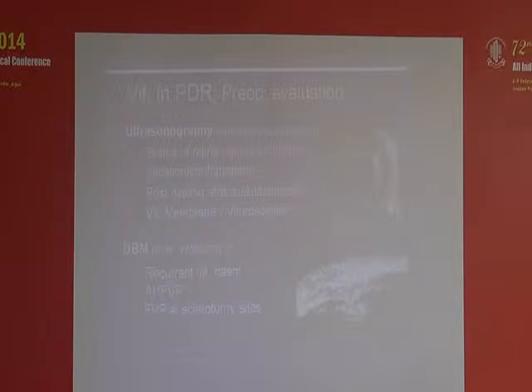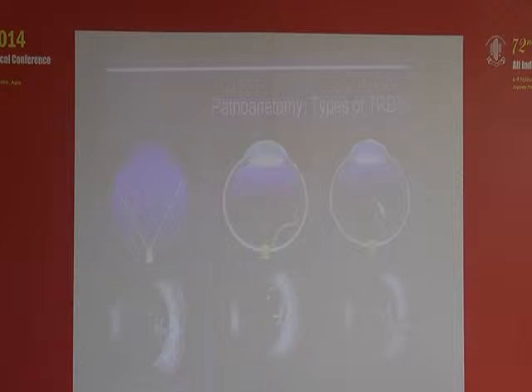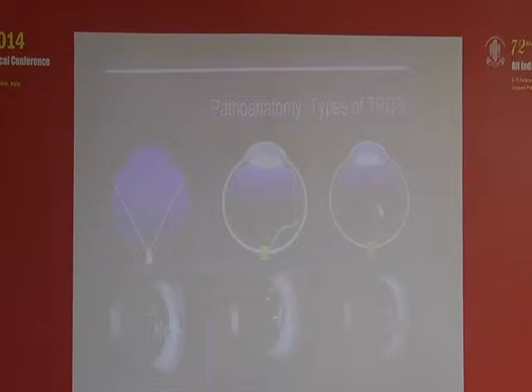So the goal in PDR surgery is basically first to clear the media opacity, important in patients where we get recurrent vitreous hemorrhage, and it gives us an idea about the sclerotomy sites, whether there is a fibrovascular proliferation or an anterior hyaloid fibrovascular proliferation. It's important to know the pathoanatomy, where there is a point attachment of posterior hyaloid, a dense attachment which is a broad attachment, or there are multiple focal attachments of the hyaloid causing the traction.